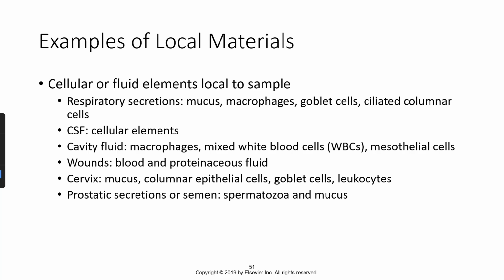Or why isn't this here? Or what is this stuff in the background? So it's not just a matter of following procedure. And this is why microbiology really can never be 100% automated. It has to be evaluated by a person, because a person looks at the specimen and asks those types of questions. Does this make sense?